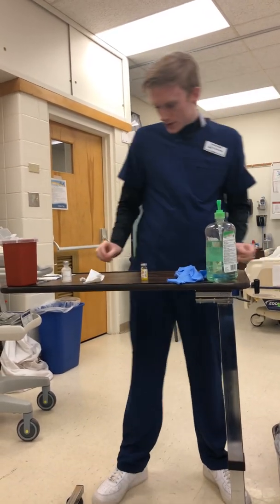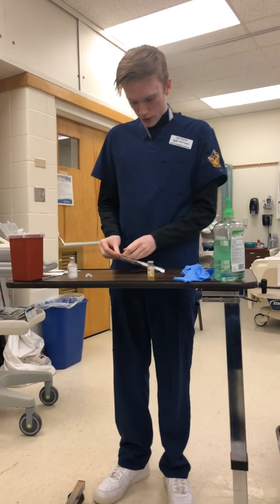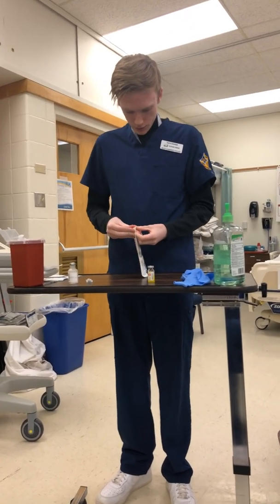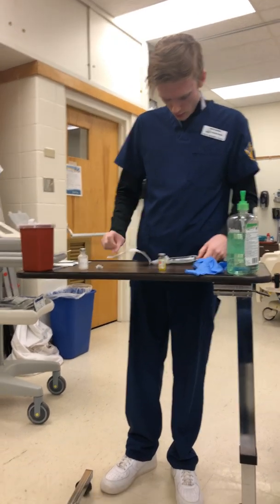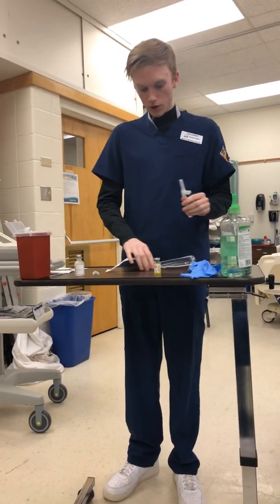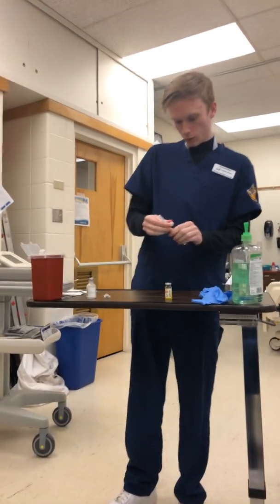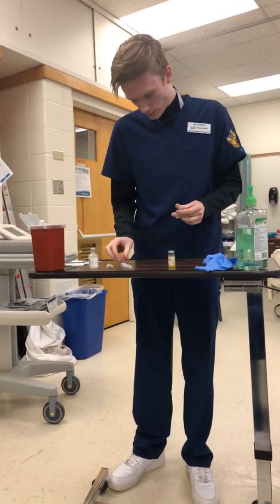And now that that is done, we will be using the syringe that we're going to be administering to the patient. Although we will be taking off this first needle and putting on a new one to draw up the medication, and then we will replace it when we will be administering the med.